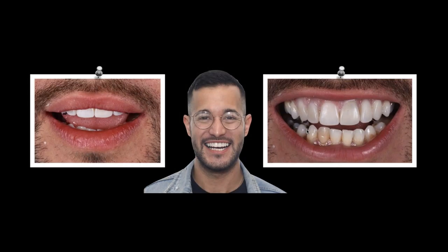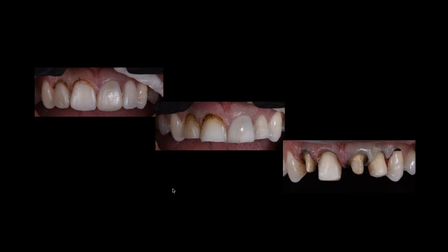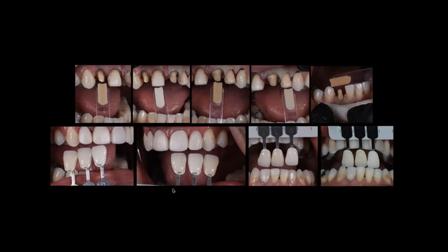So now the next problem was, we provisionalized him, and we did that by doing some crown lengthening to get the teeth in the right position. So the crown lengthening process was done, that you can see here. We raised the 7 and the 8 up a little bit, and then we provisionalized him. You'll also notice the prep challenges. So I have 2 teeth where I have a ton of space on, let's say, the 7 and the 9, and then I have 2 teeth that are very minimally invasive. And that means a material challenge for me, and how I manage that material becomes really challenging.